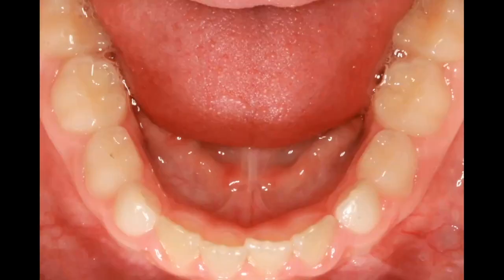How about our lower? Anything stand out here that you are worried about? I'll be impressed if you pick it up, but I think you will. Okay, we have lingual tipping, yes. Makes sense with the smaller maxilla.